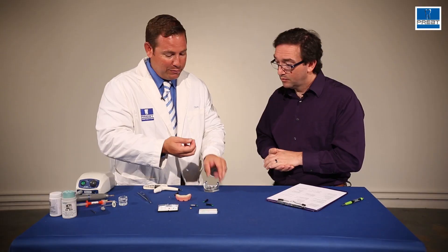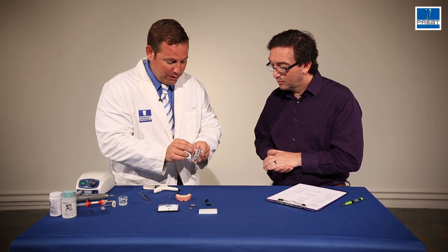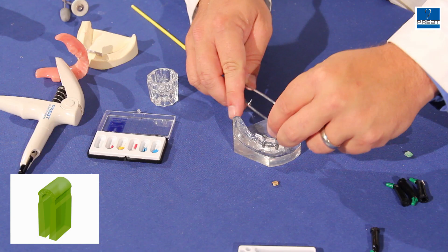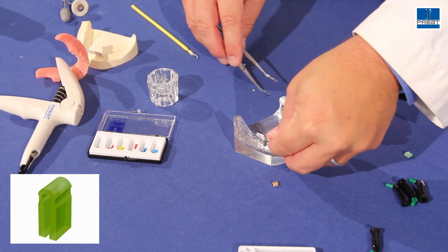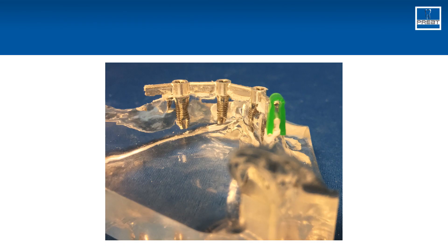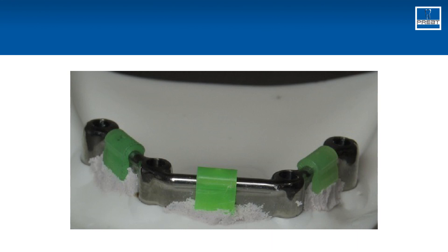Second procedure is I'm going to take one of the green processing clips, and I want to cut this down to the height of the bar. When I snap this down into the area, I am going to pick up the final clip. I'm going to snap it down onto the bar. You can tell that this is too high because it doesn't want to seat all the way, and it starts to spread. So if the green clip is too high, it's a very easy procedure. I'm going to shave down a little extra off the wings here. I find taking a burr is the simplest, easiest way. Peels right off.